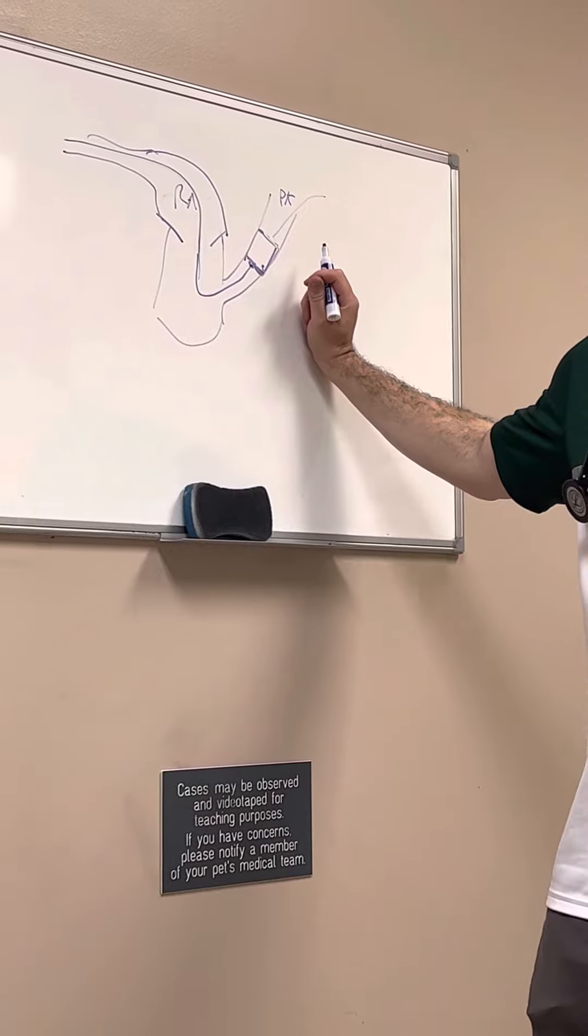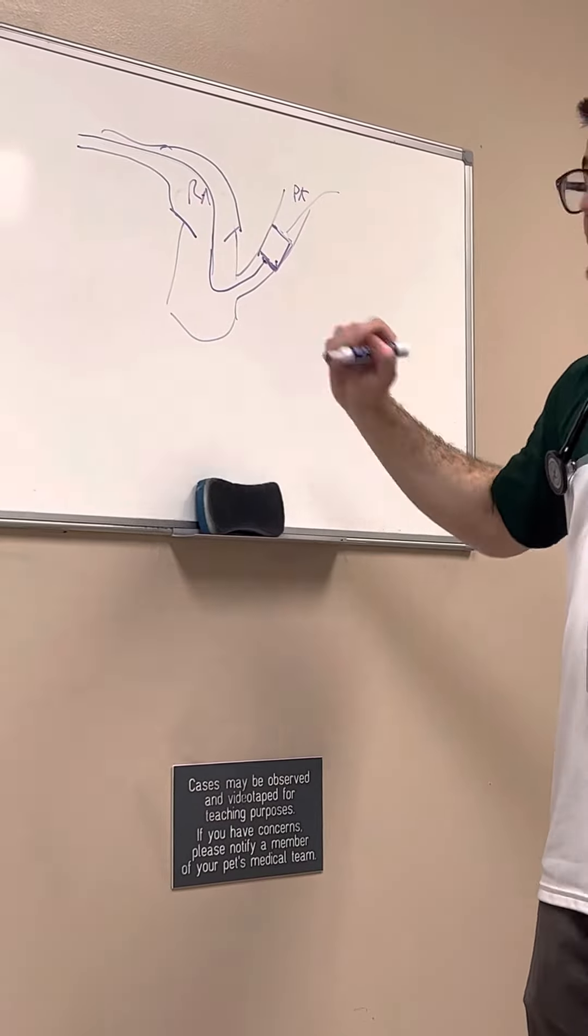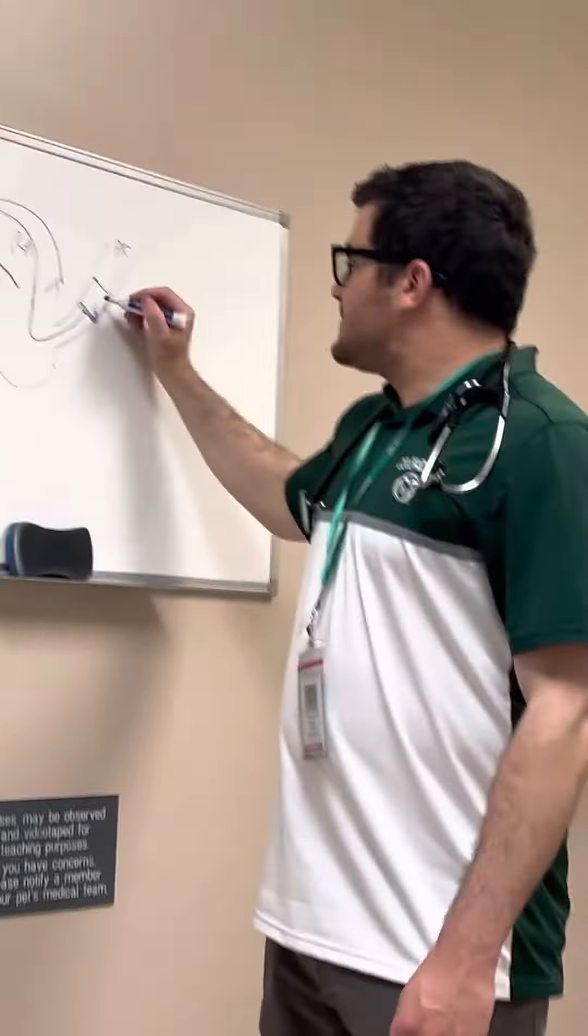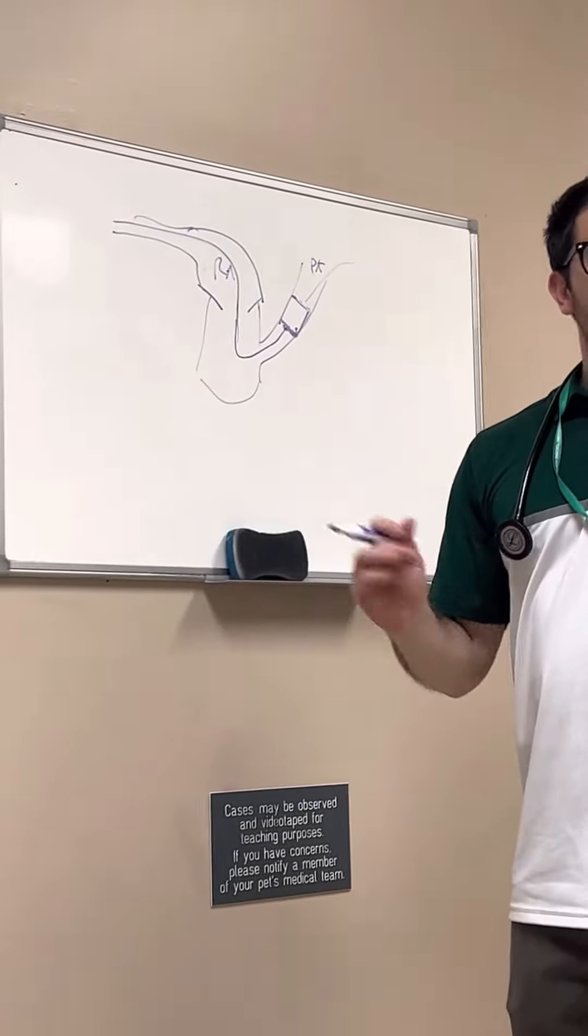We will use both the transesophageal echo, as long as she does okay with it, as well as fluoroscopy. So we'll use real-time x-ray to make sure that the stent is in an appropriate position, and we can adjust things slightly afterwards as well.